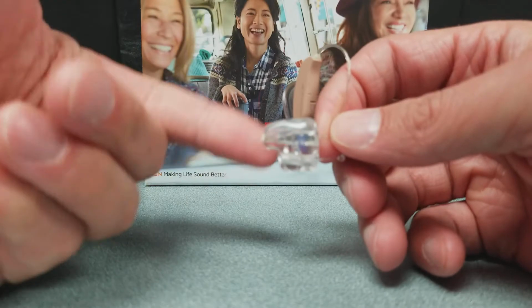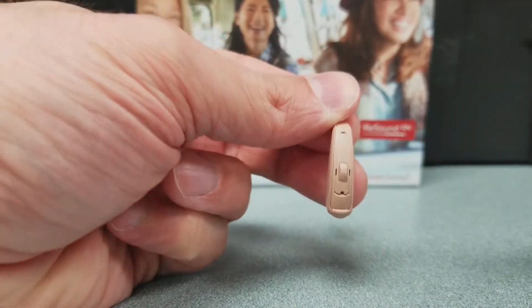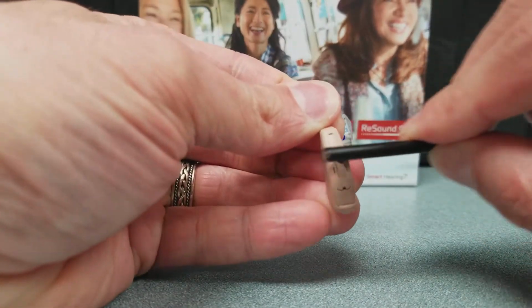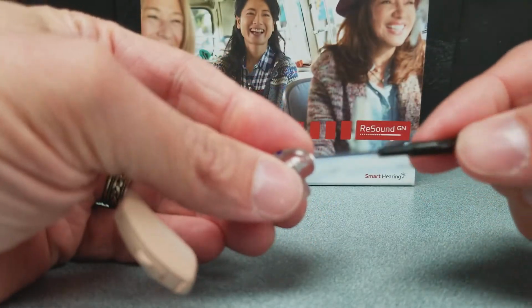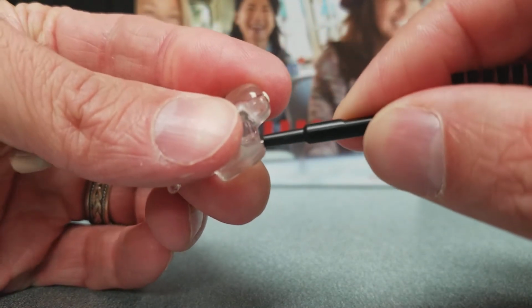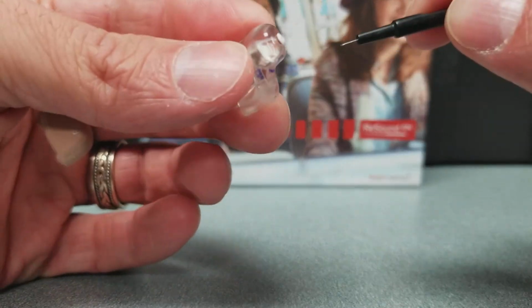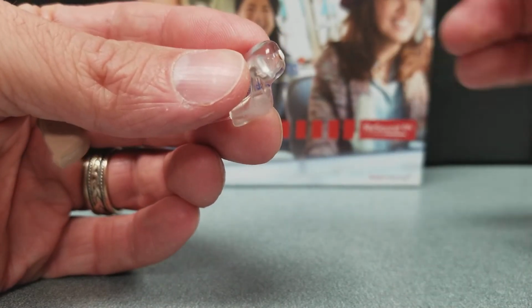Okay, after you wipe it all down, you're then going to take your brush and you're going to brush your microphones. So start at the top, work the middle and the bottom. Just brush them all down really, really good. After you brush your microphones, I want you to then take this little silver clip right here, and you're going to insert it inside of this hole, and you're going to scrape 4 times. You're going to scrape up and out, wipe it off in a tissue, reinsert it, scrape down and out, wipe off in a tissue, scrape left, wipe off in a tissue, and then right, and then that's all the maintenance.